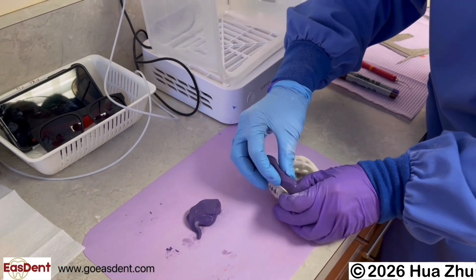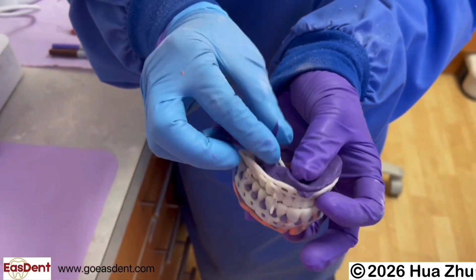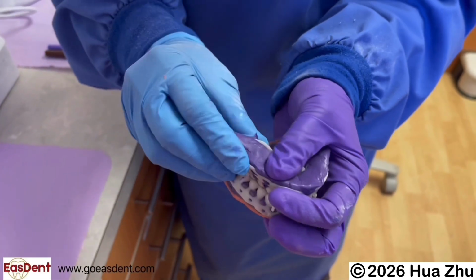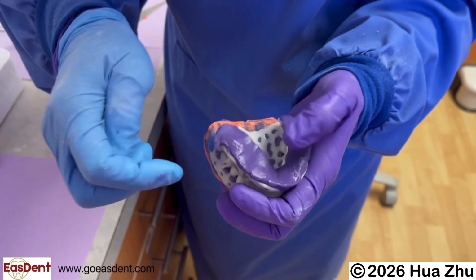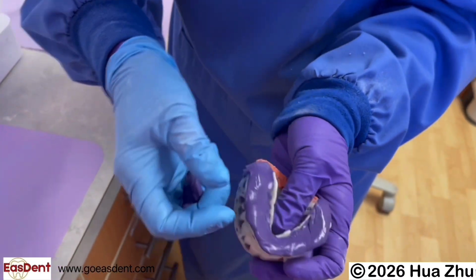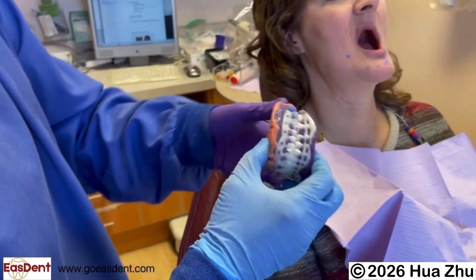Put less moldable material, leaving the buccal and lingual support area not covered, especially the lingual area. It is a little difficult to do the border molding at this stage. You want to focus on the teeth position and occlusal relationship, not on having overextension of the border.